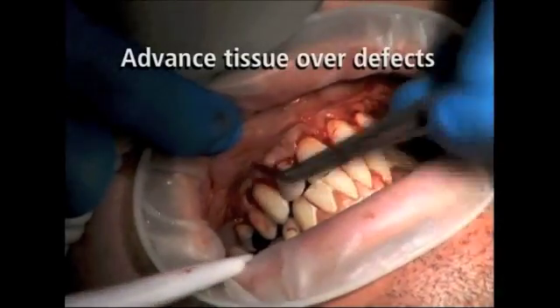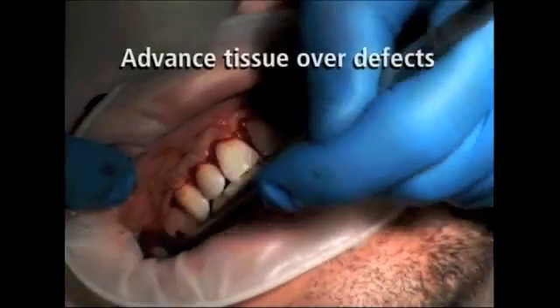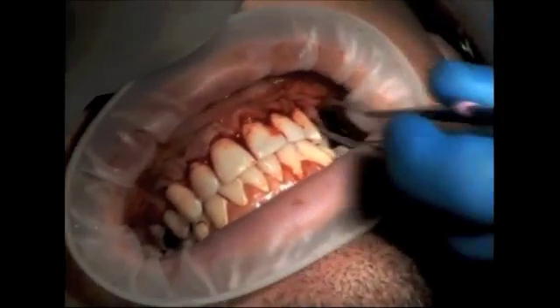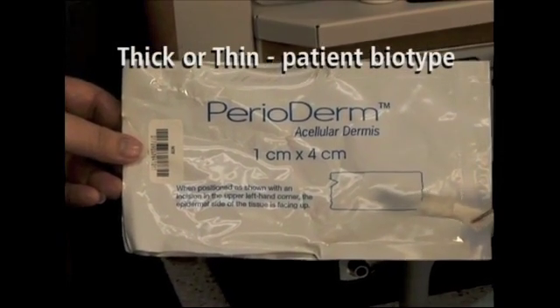While performing this periosteal release, care must be taken not to perforate the flap or any vital structures. Once the flap has been properly mobilized, it is now time to open the perioderm material.